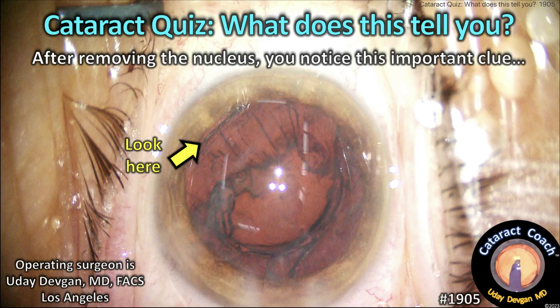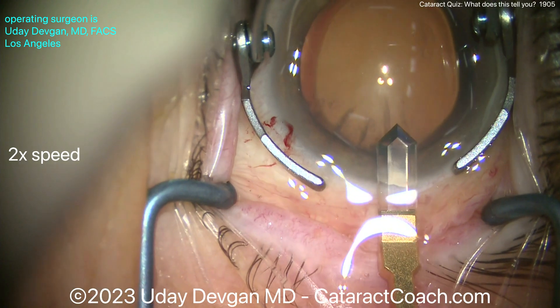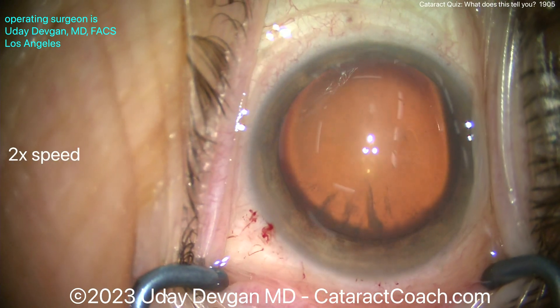cataractcoach.com has a cataract quiz. What does this tell you? Look carefully at the picture, right at the arrow. What is that? Let me show you the case here.